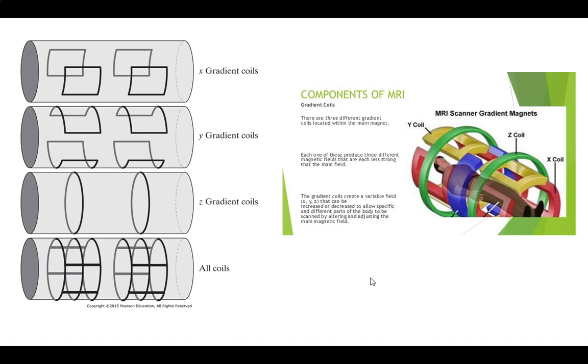Yeah. So are you saying basically the different orientations of the gradient coils determine which plane you're imaging? Yeah, how strong you set those.